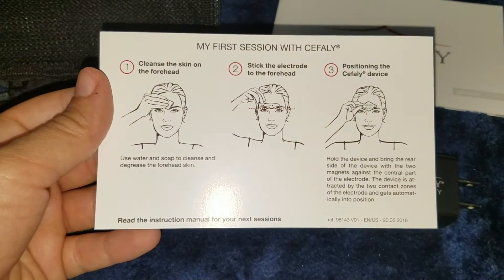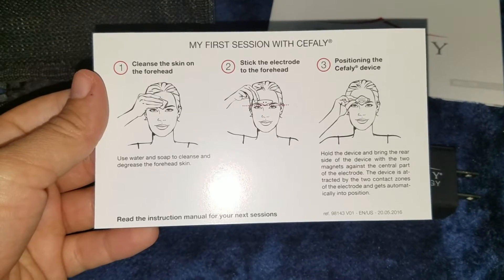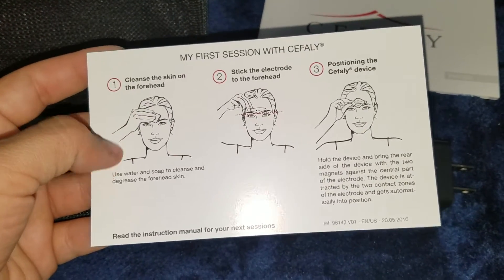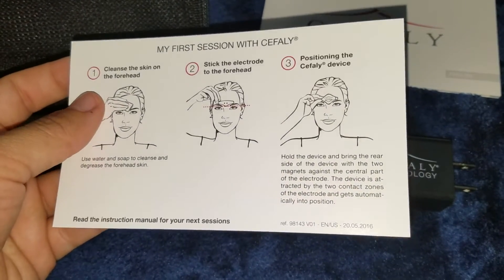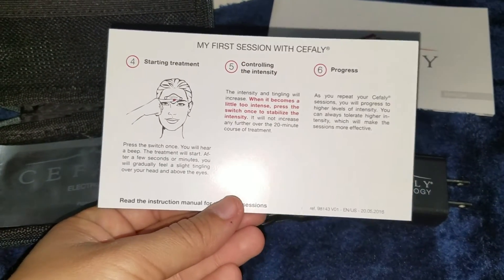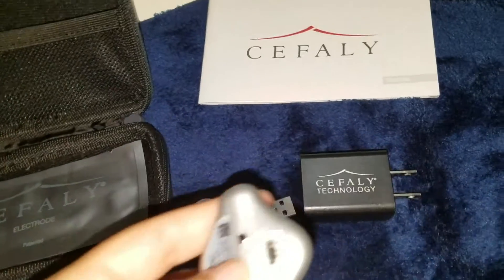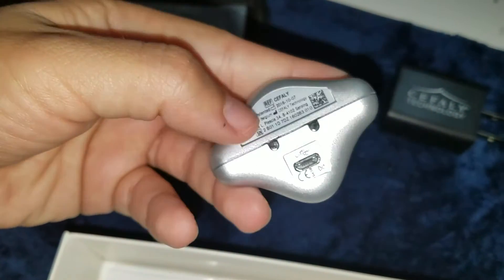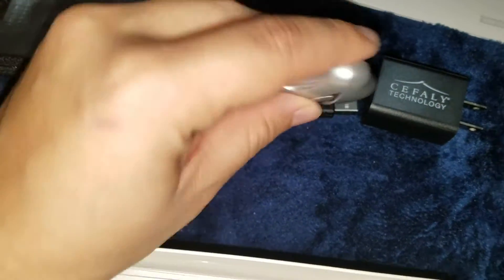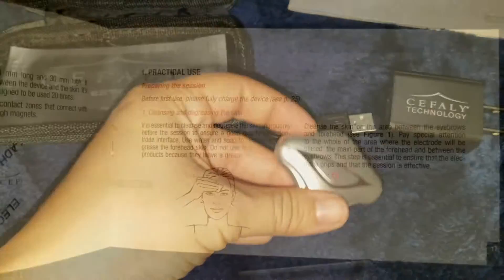So the card says for the first session with Cefaly, you're supposed to cleanse the skin on your forehead, stick the electrode onto the forehead, and make sure it's leveled with your eyebrows. Then on the other side, you can start treatment — you press it once, and then you press it again to control the intensity. The device is magnetic, so it goes straight onto the electrode piece that's sticking on your head.